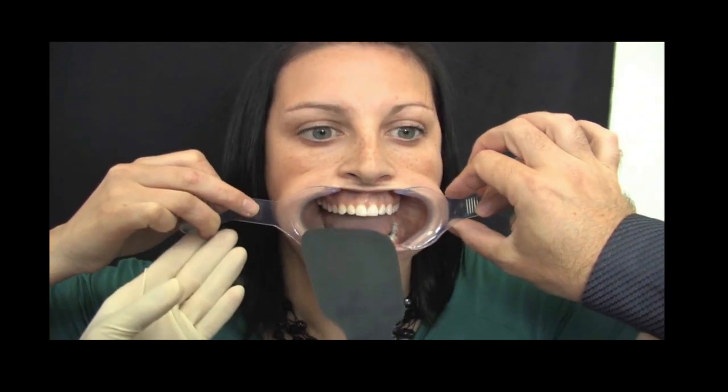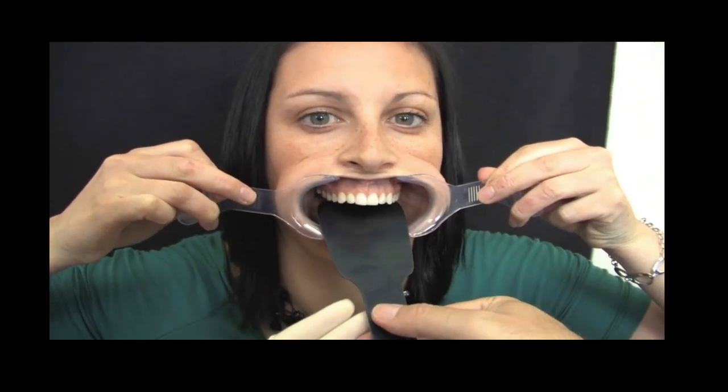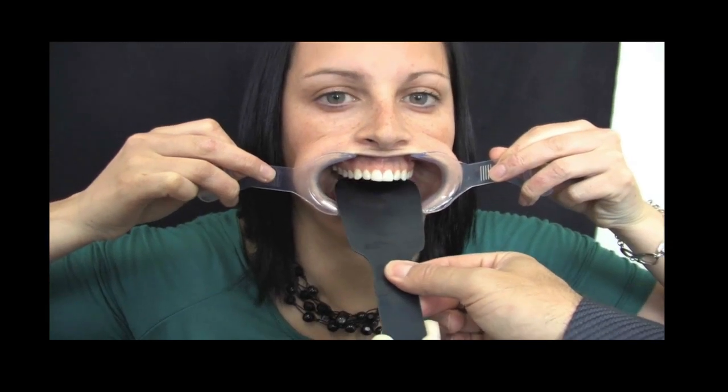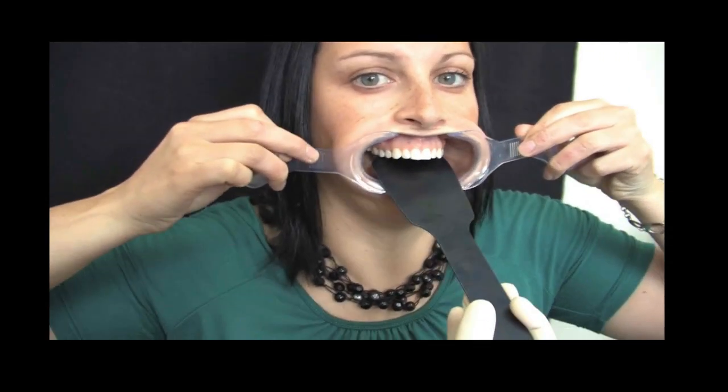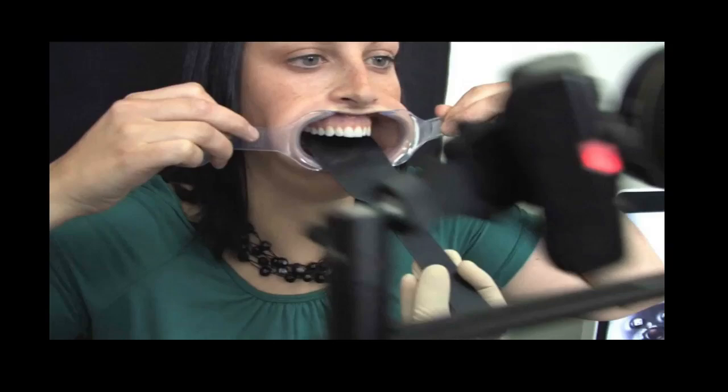The next image is the close-up one-to-one view with the black background. A lot of my close-up views have a black background — I haven't done that in Photoshop, I've actually shot the image with a device we call the contrastor. Amanda's going to bring that in now. Put in the retractors, Melissa, and we're going to lift her upper lip up pretty high and open wide. The contrastor is just a little black steel background that goes in place.